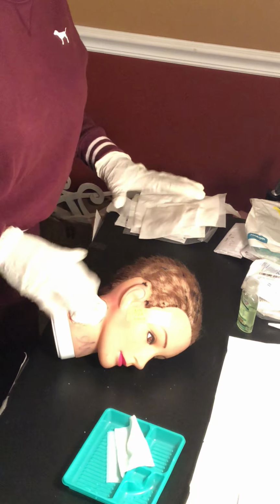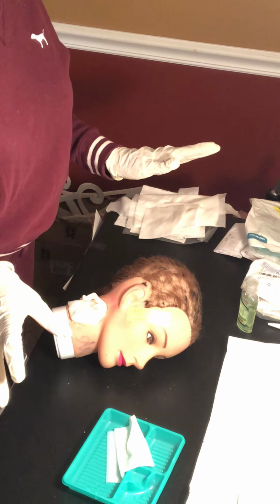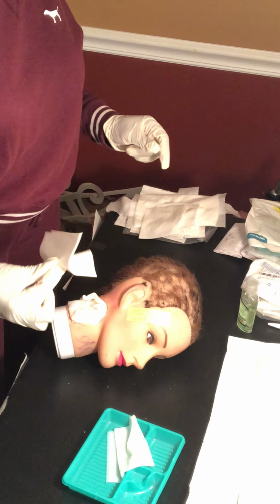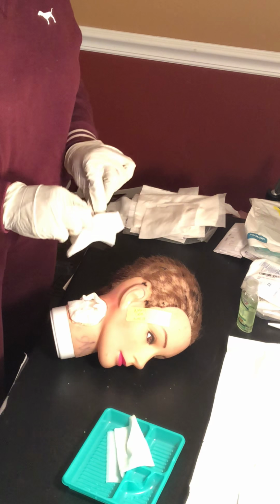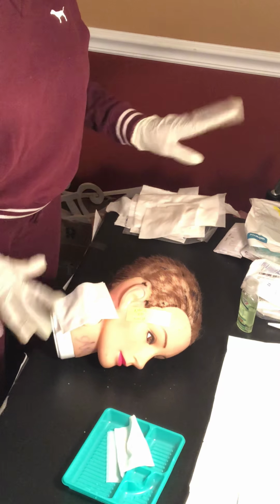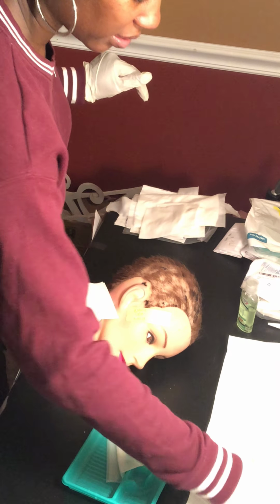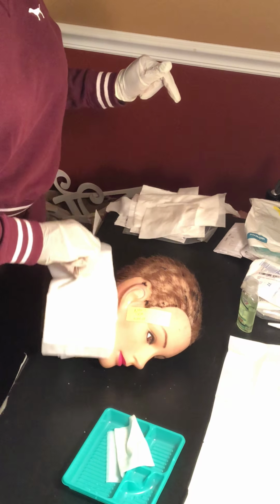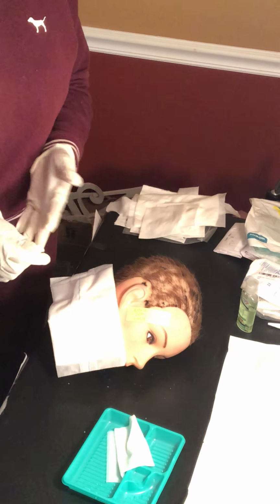So anyway, I did that. So now I'm gonna take a dry 4x4. I'm just gonna place it on there. Don't move it around because I guess that means it's contaminated. And then I'm going to take the ABD pad and just drop that on there. And now I can take off my sterile gloves.